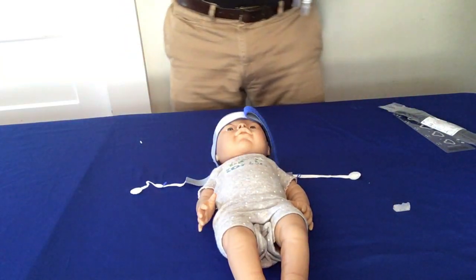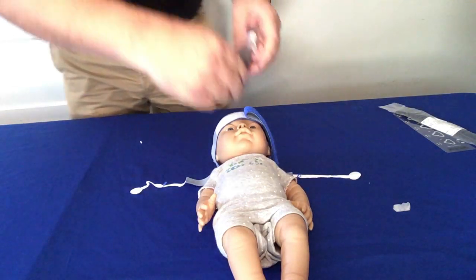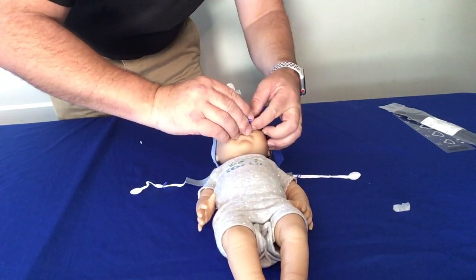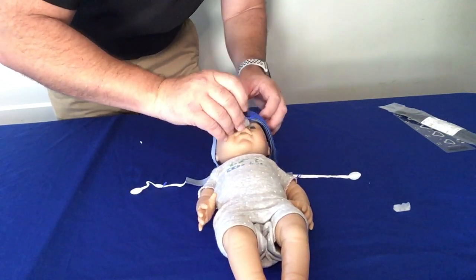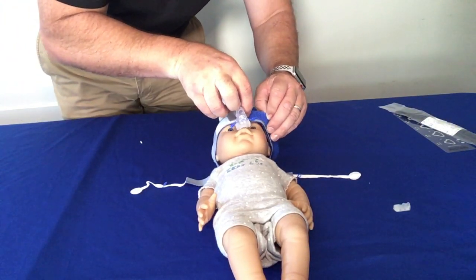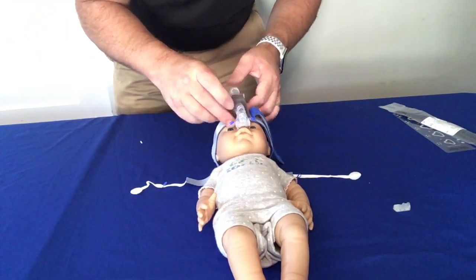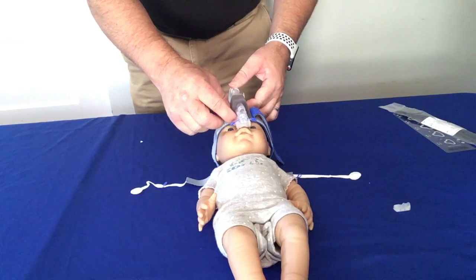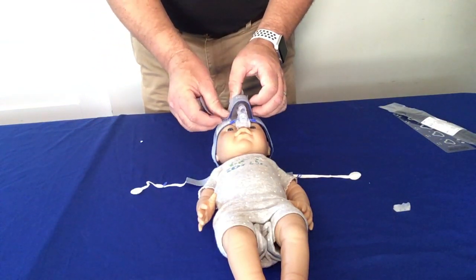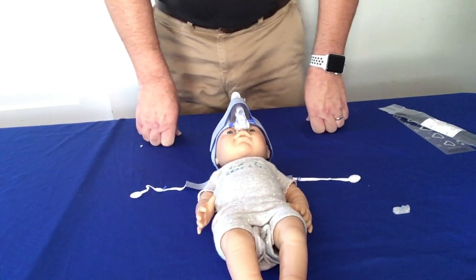So my baby is going to have some prongs, so we'll go ahead and put prongs onto this interface. And again, putting the prongs into the nose of the baby. And you're going to use the same sizing guide as you would if you're going to use the bonnet when choosing the prong size. And I'm going to back this up a little bit more, making sure that the foam block is in the center of the head. And then at this point, go ahead and affix this onto the other side of the Velcro like that.